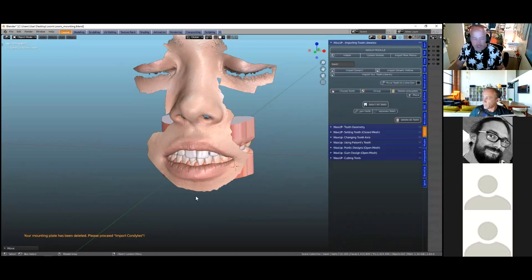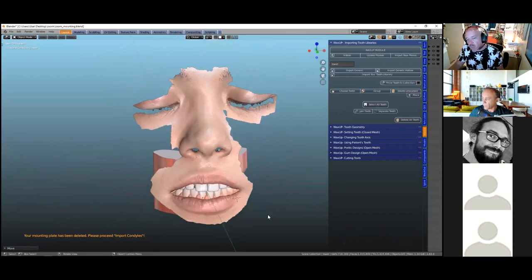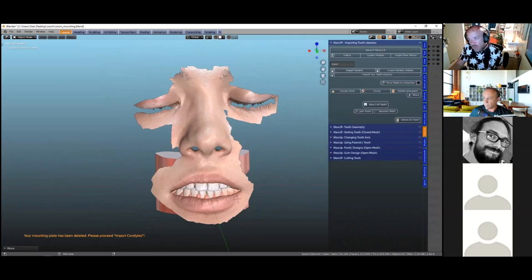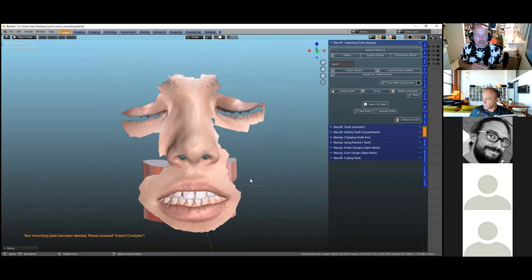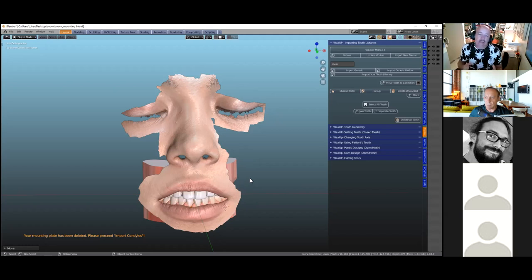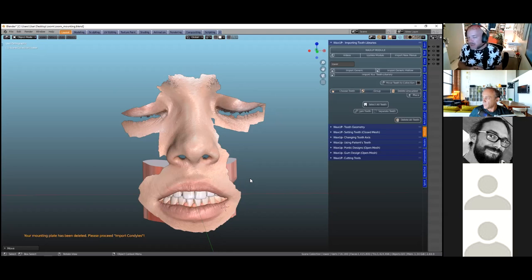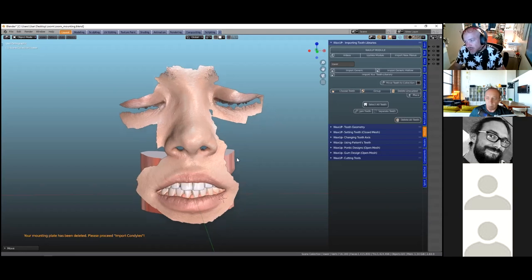Now I'm going to go into the wax-up and start waxing — in this case we'll wax a few veneers. In the wax-up module we have 'import generic teeth' and 'import hollow teeth'. There's a big difference: solid teeth are used for aligning teeth into the model for diagnostic wax-up; hollow teeth are used for gum pontics, thimbles, and similar. We sometimes have to make our tooth library hollow, and we've got special functions for that.